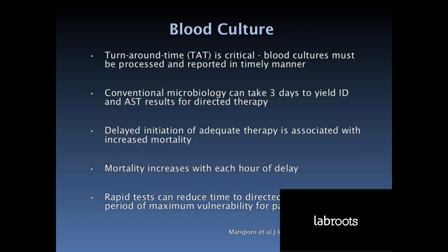Some basics about providing a blood culture service. Speed and accuracy are essential. The shorter the turnaround time, the greater the chance of saving a patient's life. If a blood culture comes to the lab, it must be processed immediately. When staff start their shift and there are positive blood cultures, and growth from cultures of other less urgent specimens, the blood cultures are the immediate priority. If there is something to report from a positive blood culture, report it as soon as possible.